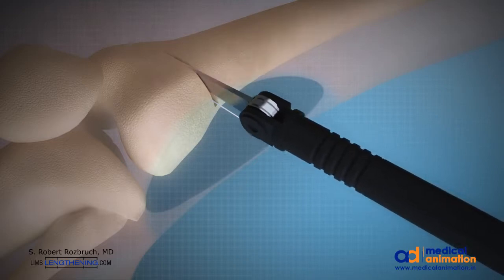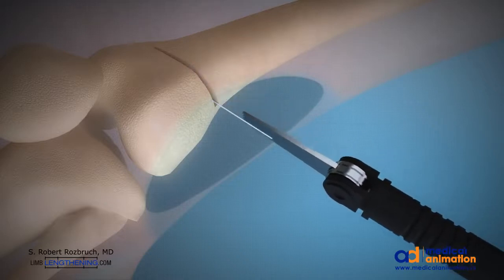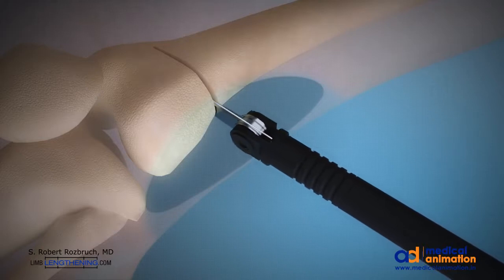Retractors are placed to protect soft tissues. Care is taken to avoid cutting the medial cortex to keep the osteotomy stable.